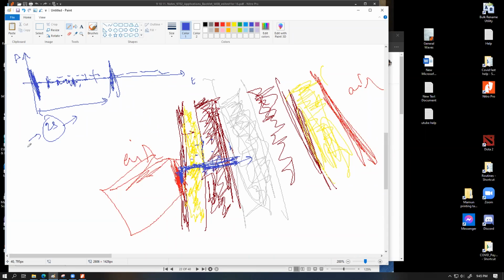But after we send one pulse, there will be multiple reflections detected depending upon each of the boundary changes that the sound wave has to go through. How much intensity we detected and how late we detected it will tell us two pieces of information: how hard or soft that surface is, and where it is located, or what the thickness of that boundary is. Together, these two pieces of information give us one line of data. Now, this is very important information.